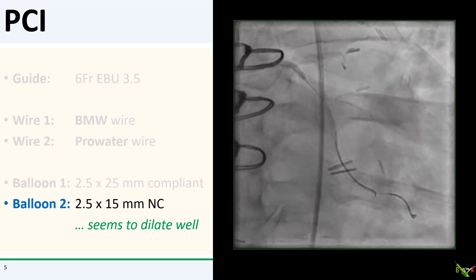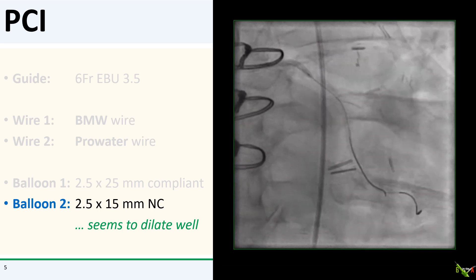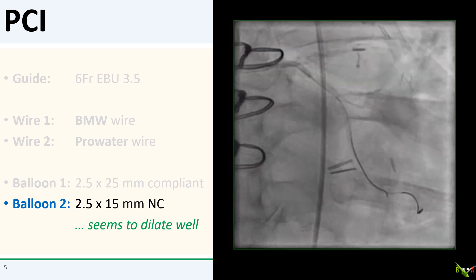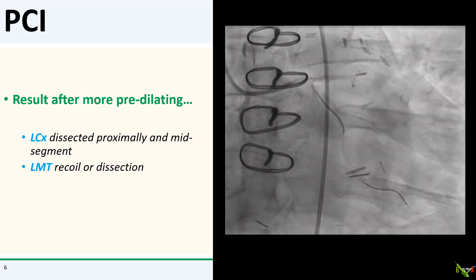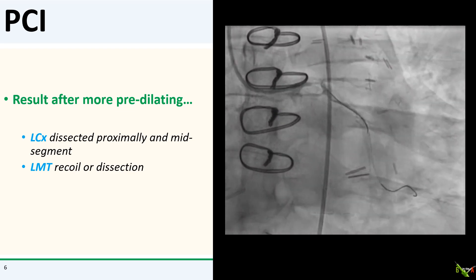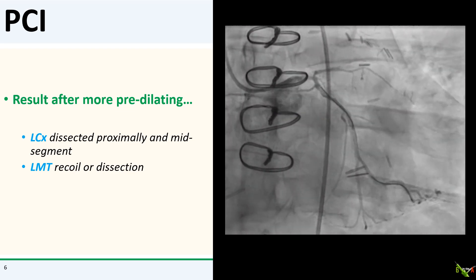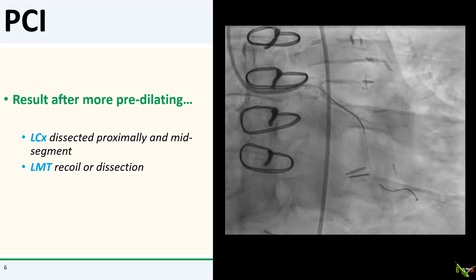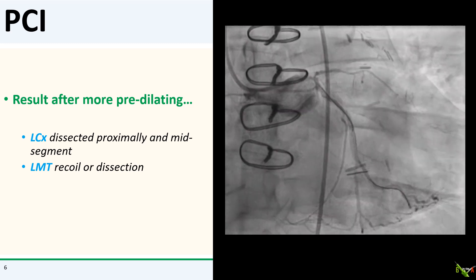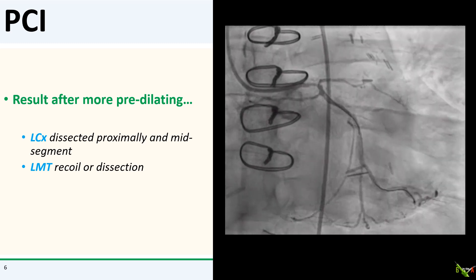Again with the buddy wire in place, I passed an NC balloon for more lesion preparation, and again the NC balloon seemed to dilate fully. Here is what we have after dilating with the NC balloon. The circumflex now seems to be dissected proximally and in its midsection. The left main also either dissected distally or recoiled. Not a big deal — unexpected after a balloon dilation. Let's just stent the whole thing.